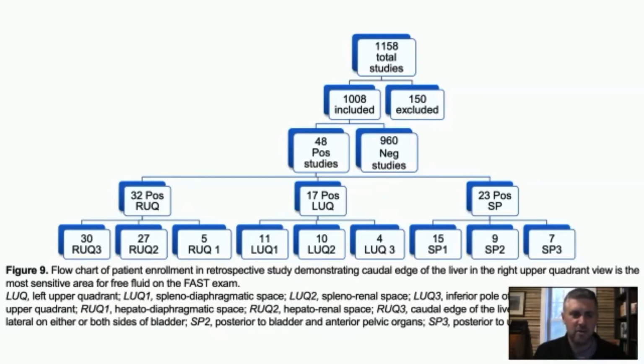right? Which kind of makes sense, kind of going back to this study that we'd seen. The caudal tip of the liver is the most commonly seen place where you have fluid. And so you can think about it like this: if you have an injury, right, and the patient's walking around, they're going to get fluid to collect in their pelvis, right? As you lay them supine, that fluid is going to migrate up the paracolic gutters and then into Morrison's pouch. And so Morrison's pouch, while one of the most gravity dependent areas in the belly, the fluid has to get there somewhere unless it's coming from Morrison's pouch, right? And so it's going to come from somewhere else, enter into Morrison's pouch via that caudal tip of the liver. And so it's not uncommon to see it collect at that caudal tip of the liver as it's dumping itself into Morrison's pouch. So it makes sense, right?